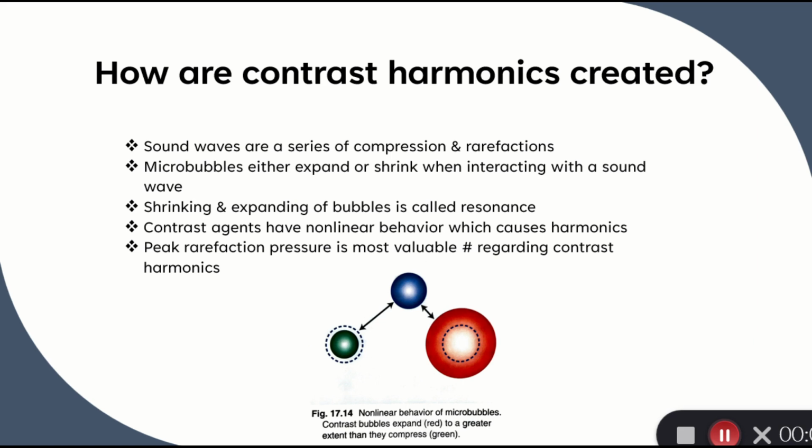Bubbles expand to a greater extent than they shrink. They can only get so small due to pressure balance. They do not have a limit on how much they can expand, though. This is why they have nonlinear behavior, which creates the harmonics. Peak rarefaction pressure is what expands the bubbles and is the most valuable number regarding contrast harmonics.